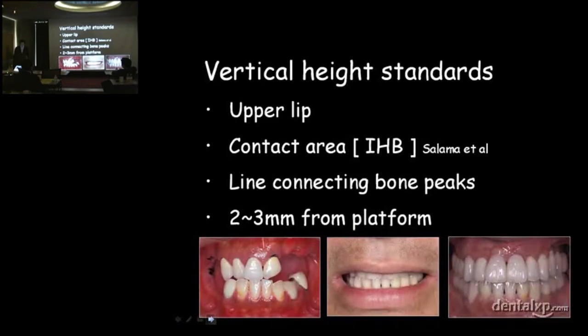As we know, upper lip position is a basic standard for every prosthetic procedure. We can estimate where the bone height should be from the resting upper lip position. There are several other standards for vertical bone height.